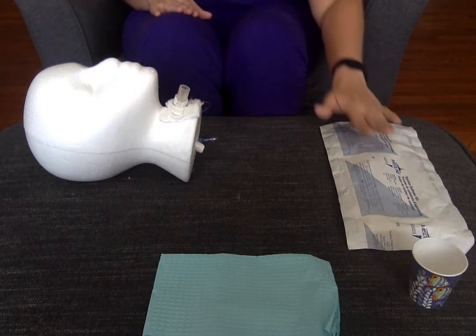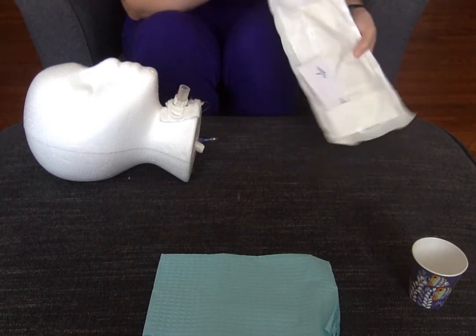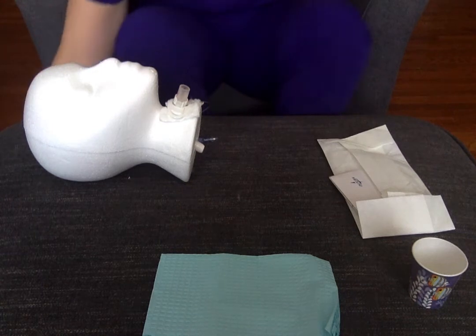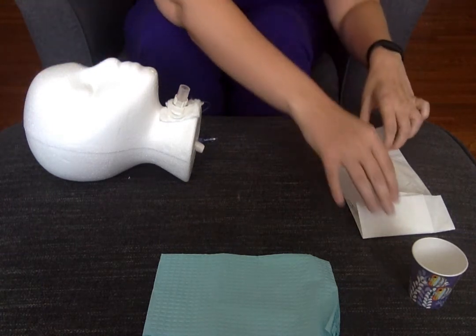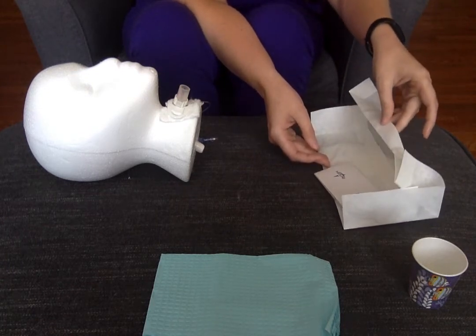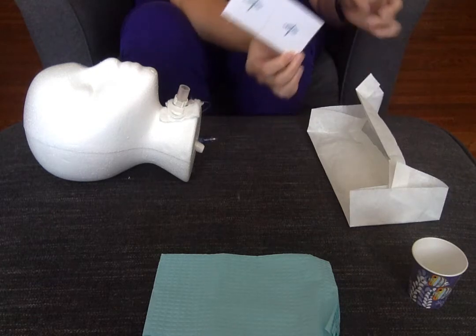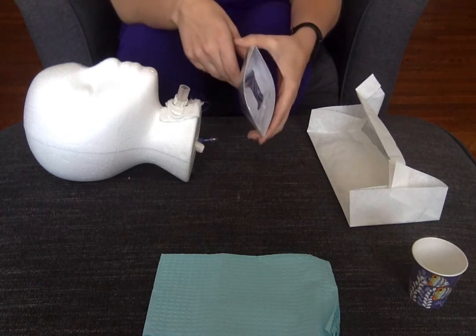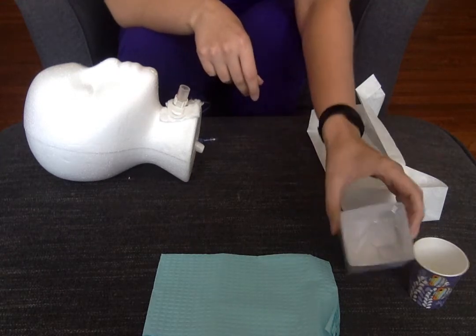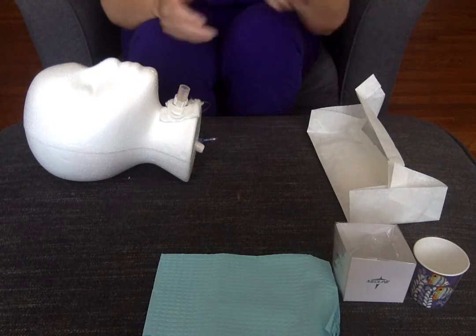Now I can open my packaging. I'm going to open the sterile packaging and remove this kit. When I open it, it should look fairly similar to the one you guys have — it's set up really nicely. When doing sterile, I want to make sure I'm grabbing these little tabs. There's a little cup inside; you push the edges together and it pops open into a nice little cup we can use. Your kit may not be set up this way where you can get it out without breaking sterile, but if you can, it's great to do.